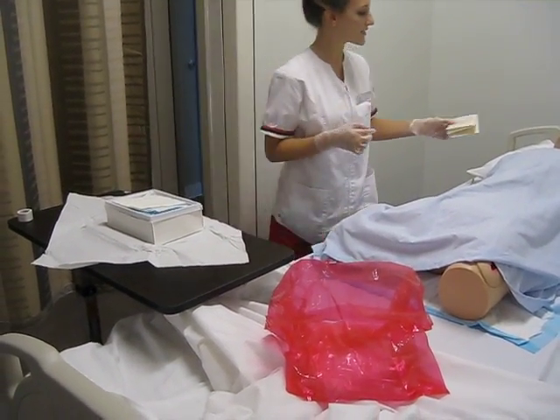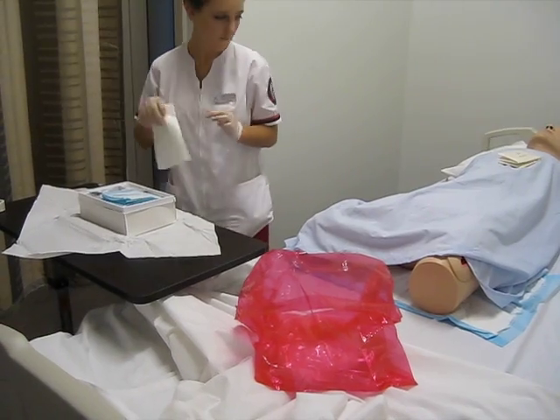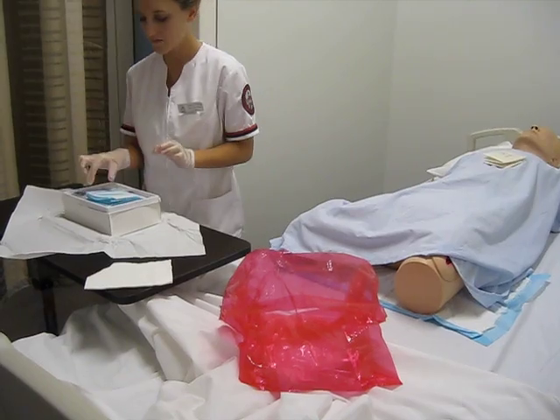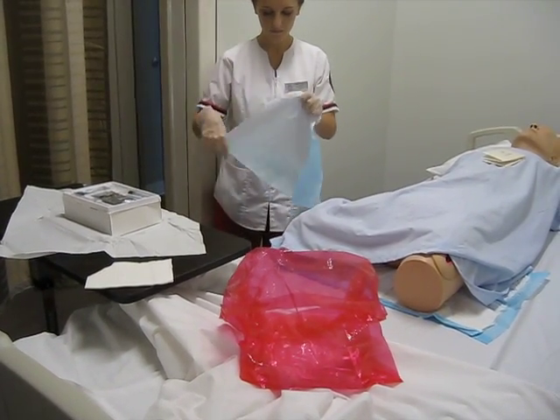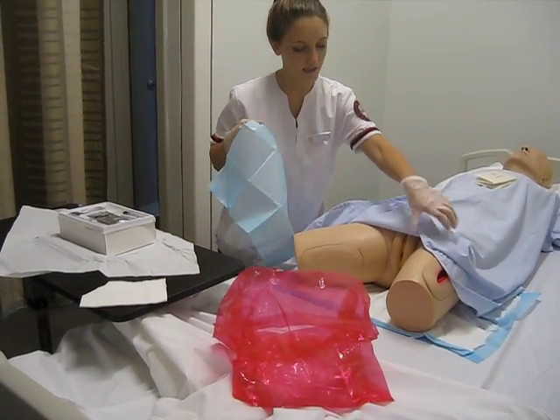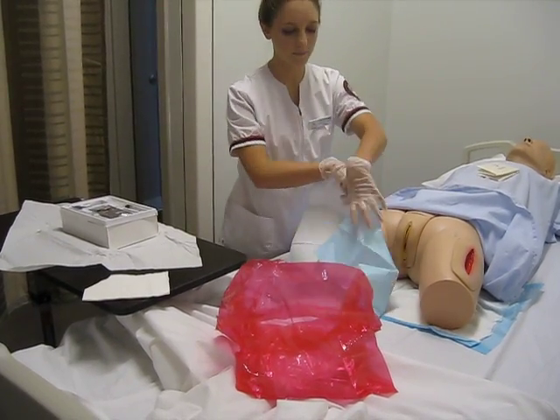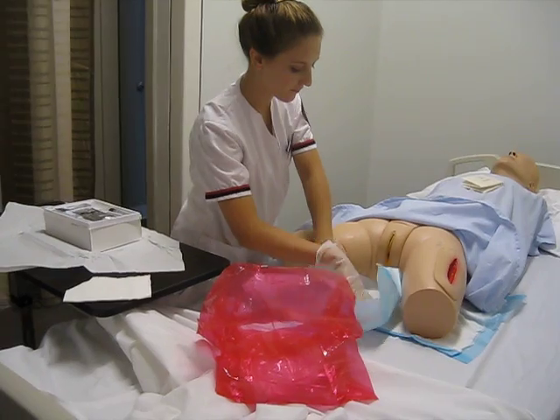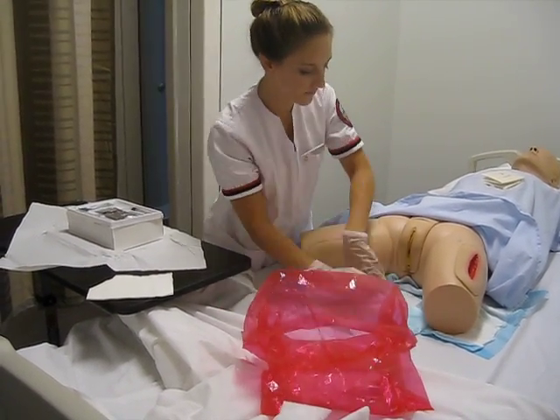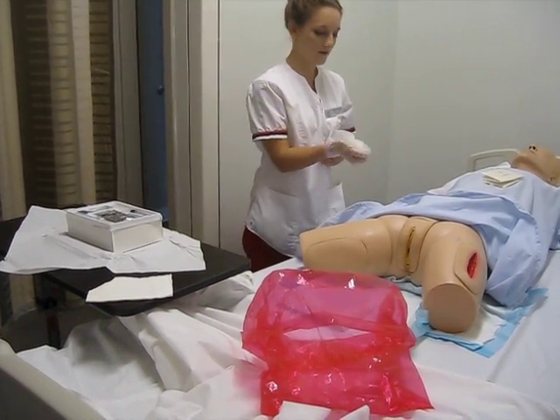I'm going to go ahead and set my sterile gloves right here. I'm going to have to expose you for a second, and I'm going to go ahead and position your legs — your legs just need to be far apart. Now I'm going to have to keep you exposed because I do have to put on sterile gloves.